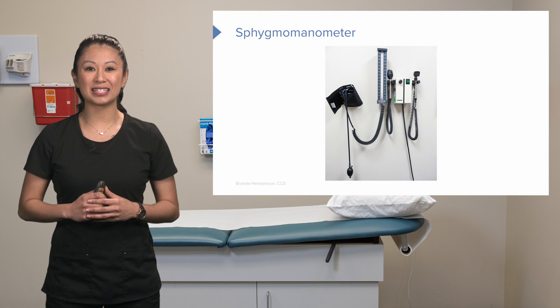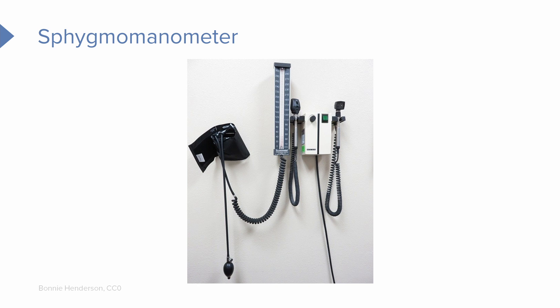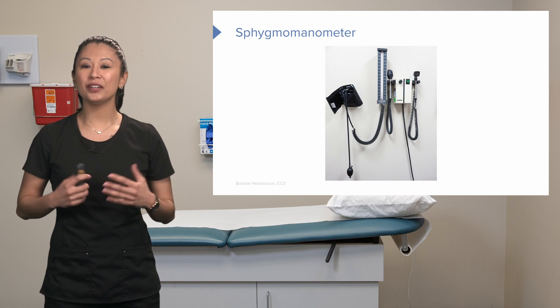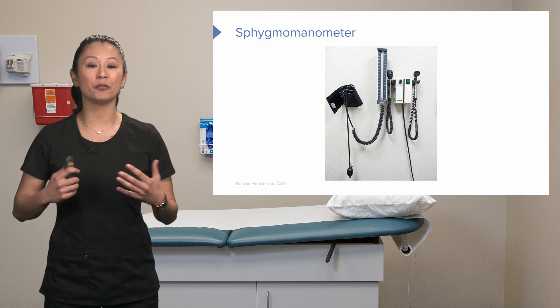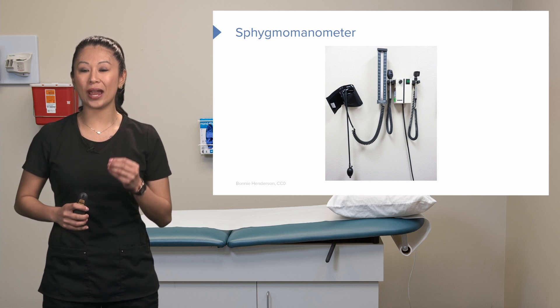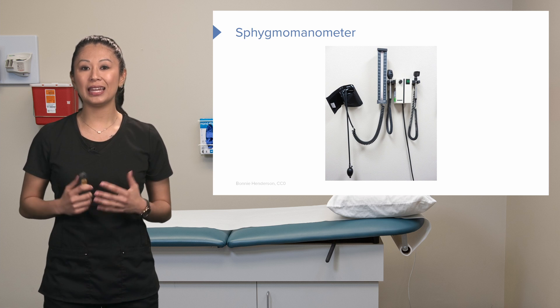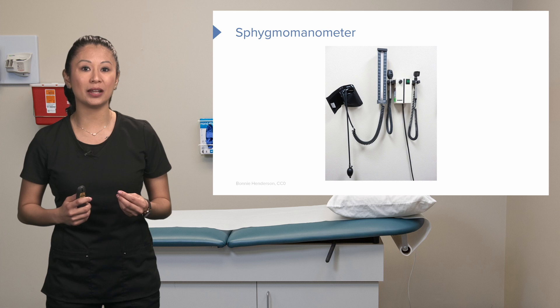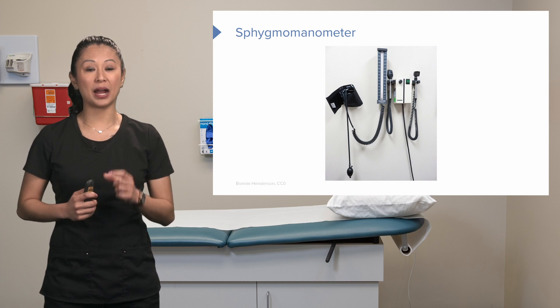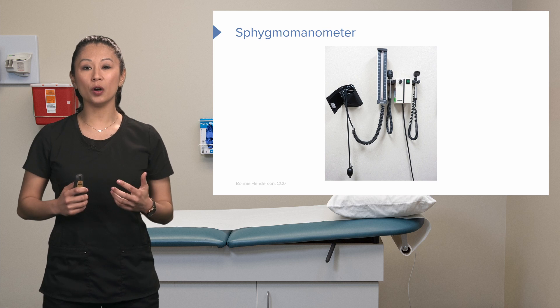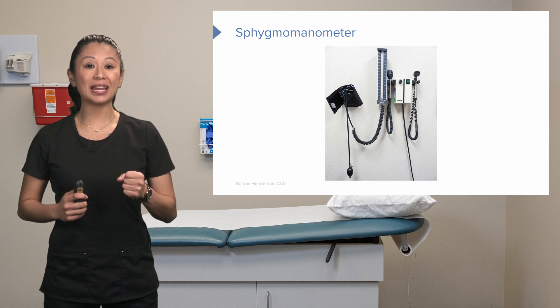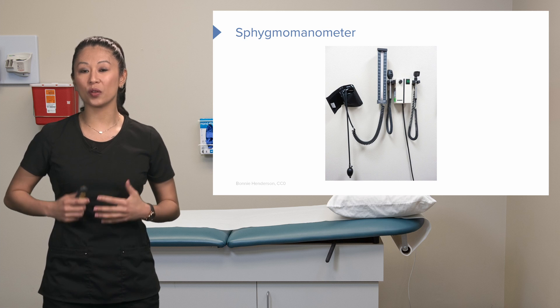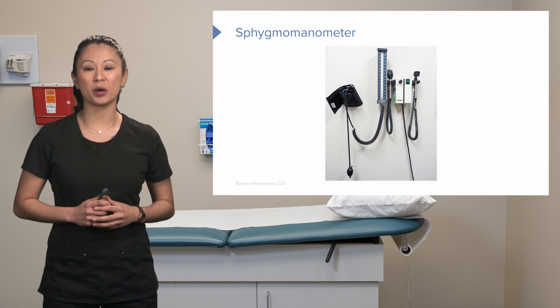Let's look at the sphygmomanometer — or as we simply call it, the blood pressure cuff. This one is hooked up to the wall, common in a physician's office for routine checkups. It's a manual blood pressure cuff, not powered by battery. We get our reading by looking at the dial with markings, and we inflate the bulb at the bottom to obtain our reading. The manual cuff is the most accurate method.